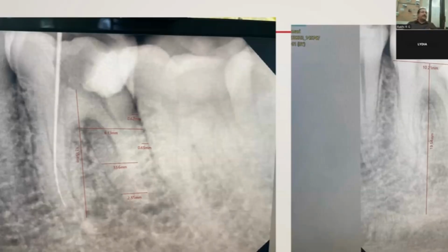Will you prefer to have a lesser space? If you need to spare 0.5 millimeters, which area will you spare: the one next to the tooth which you are not going to connect, or the portion which you are going to connect? That requires less. So leave more space between the nearby tooth and the implant than the area which you are going to connect with each other.